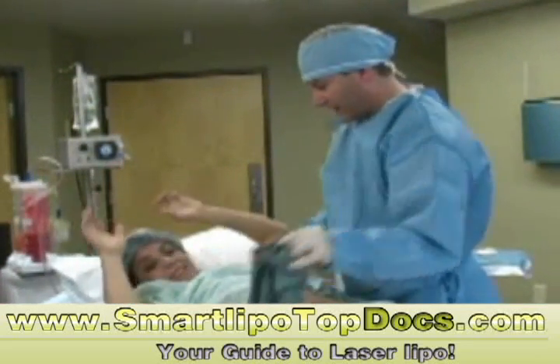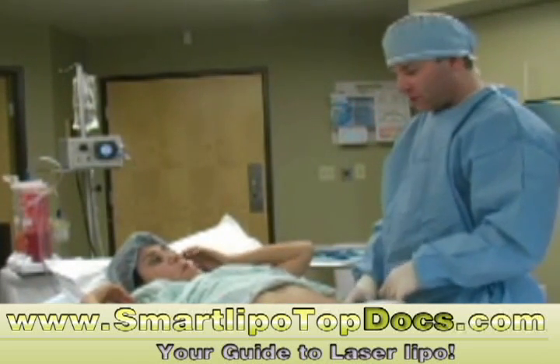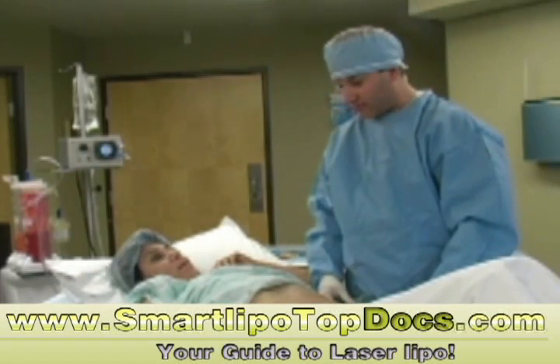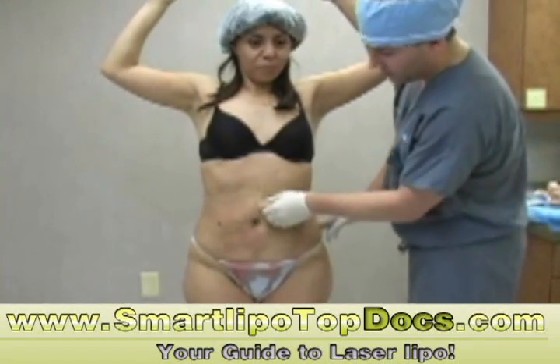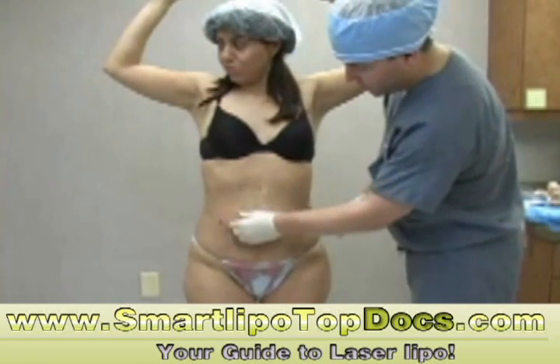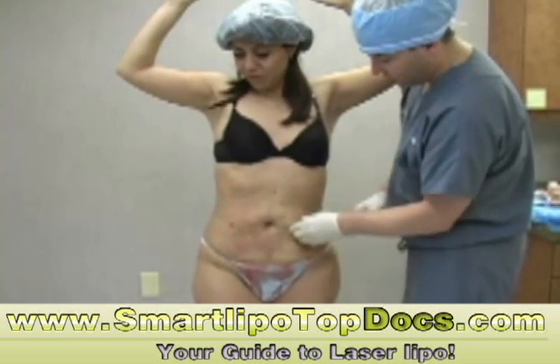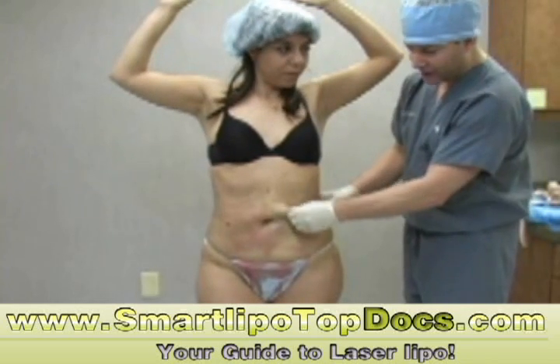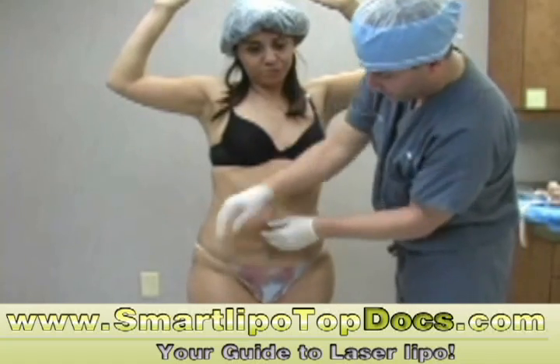We are done, Yolanda. What I'd like to do now is stand you up and get one final shot of you immediately after the procedure. And then we'll get you dressed up in your garment and get you on your way home. As you can see, this is immediately after the procedure — she's standing up. We just have a very fluid-filled skin right now that's going to take a while to contract back, and that's part of the healing process for lipo. This was just a phenomenal lipo procedure for her. We were really able to clean out the fat layer — we're left with about a quarter inch of fat.